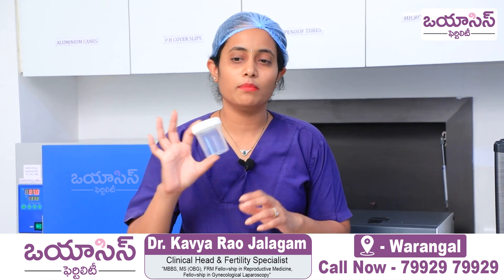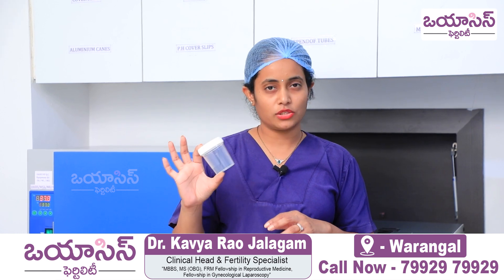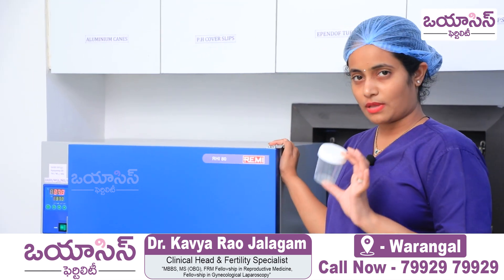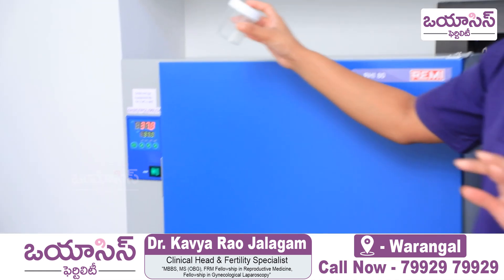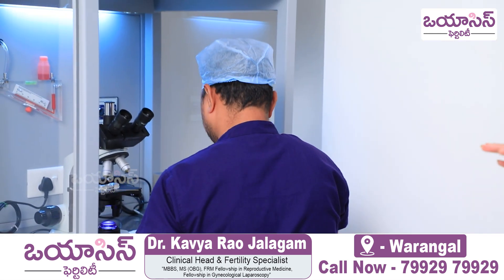This is the wide-mouth container, where we ask the patient to produce the sample without any spillage. Once the sample is here, we take a liquefaction time, and then the andrologist takes over the sample and examines it.